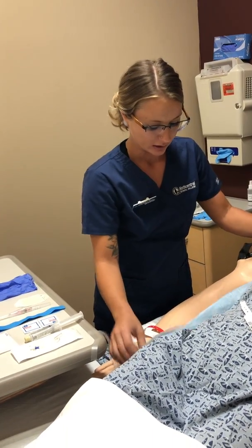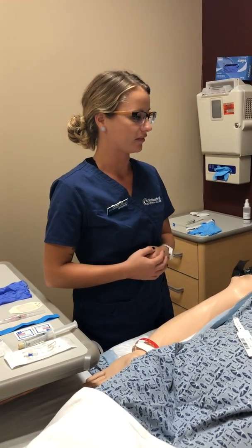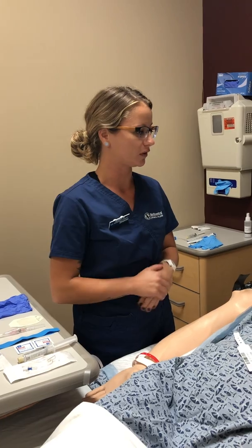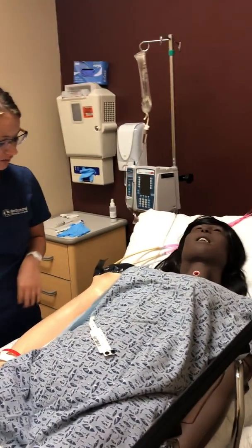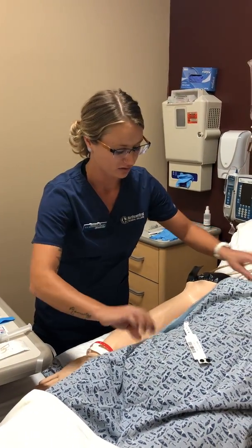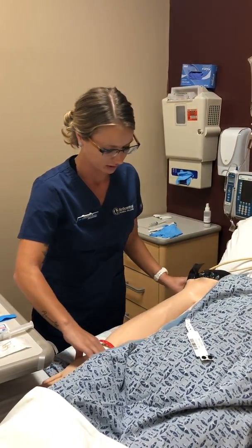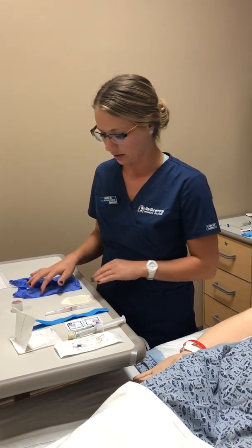All right, Mary, and I just want to make sure that she's able to follow commands in case I need an extra set of hands to help stabilize an arm and help her follow commands. But in this case, she's with it, she's alert and oriented, so that's great. All right, Mary, I'm just going to place this absorbent pad underneath your arm for any drainage. Very good. Okay. And I got all my supplies ready here.